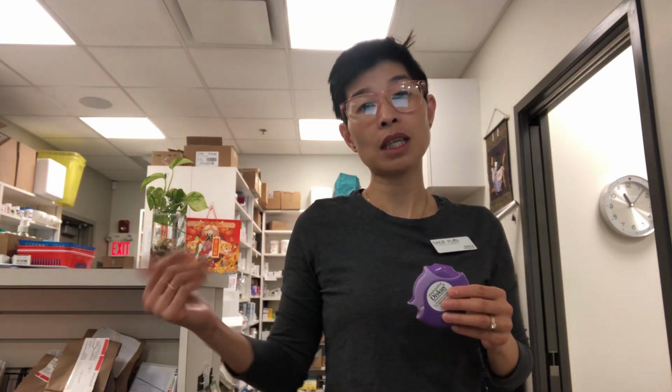And that's it. With most diskus, if there is a corticosteroid component, you do want to rinse your mouth after use. So it's a good idea to do it right before you brush your teeth during the day, and then again right before you brush your teeth at night, so you're rinsing your mouth and spitting the water out.